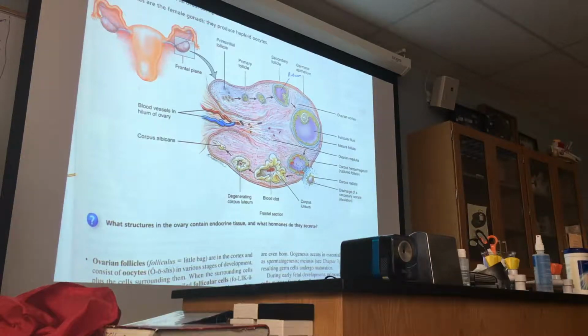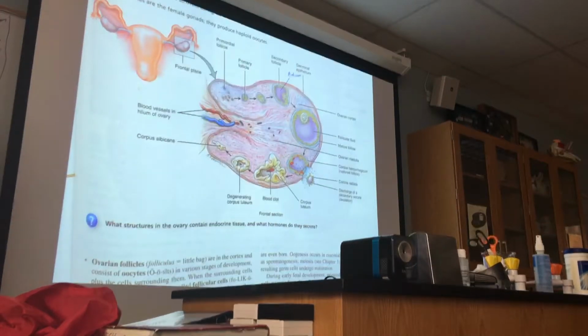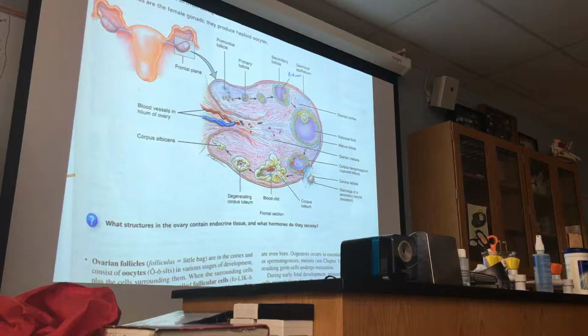Have the inner cortex, outer, no, they're wrong. Outer cortex, inner medulla. Yeah? I was saying and you were nodding, you were giving me, oh yes, oh yes. No, I was trying to mislead you.